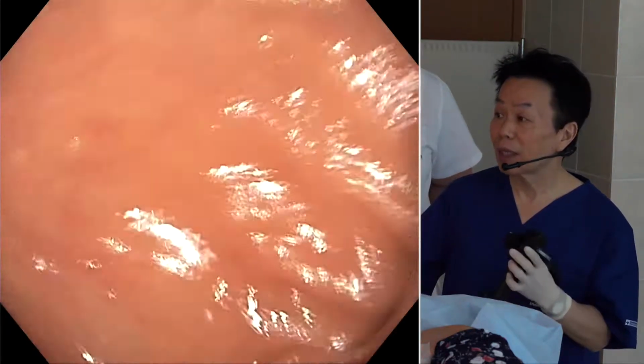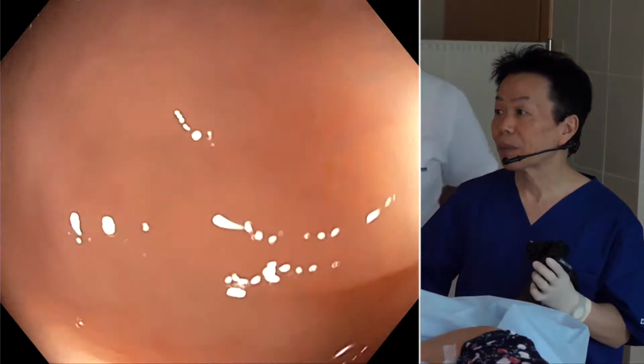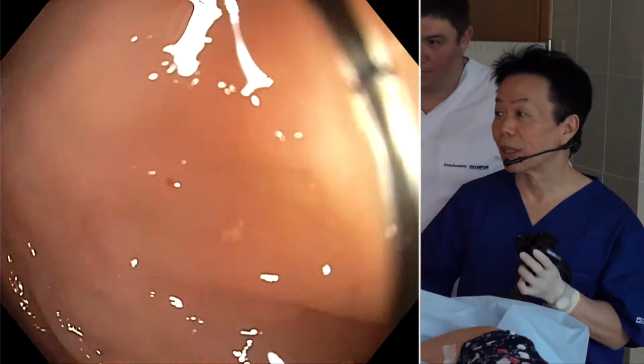So I don't try to inflate too much here. So I'm trying not to inflate too much here. And now we're using CO2. CO2 is a lot better than room air.